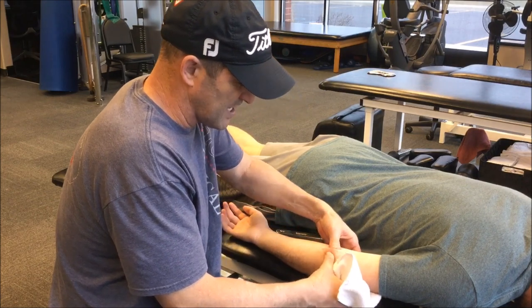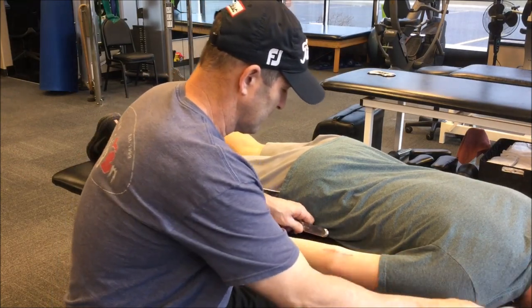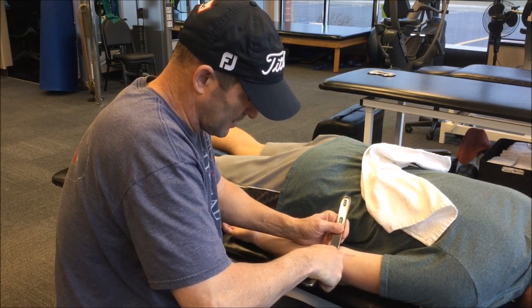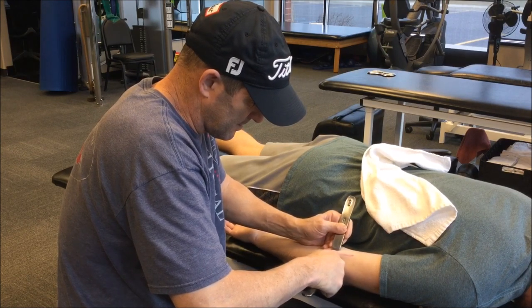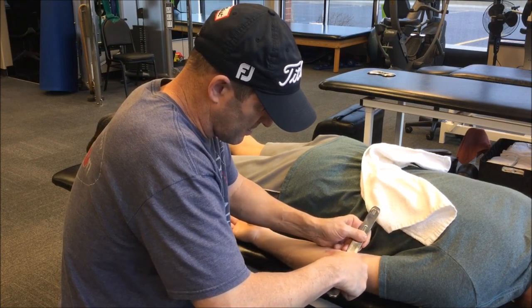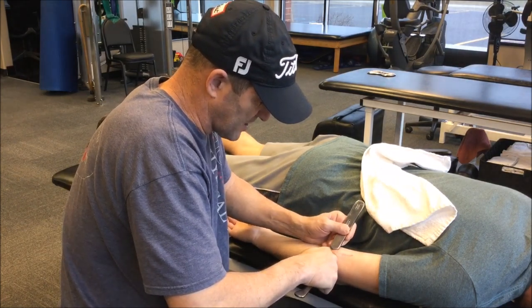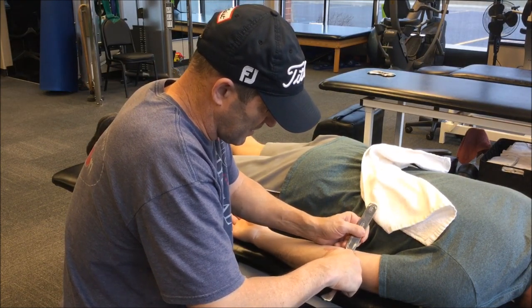Sometimes you get those deep adhesions, and the third technique I'll use is to try and lift the scar. With the beveled edges, you can go medial and lateral — side to side — and work the scar underneath. I'll push the tools towards each other, scoop, and then lift. This is the one you have to be very, very careful with because athletes will let you know. You can see there's a little bump, a little nodule we'll have to work on. When you elevate the scar you can see that much more. You start the same distance apart, bring them together, and you can feel the adhesion right there.